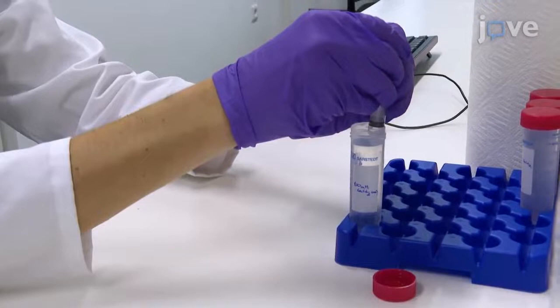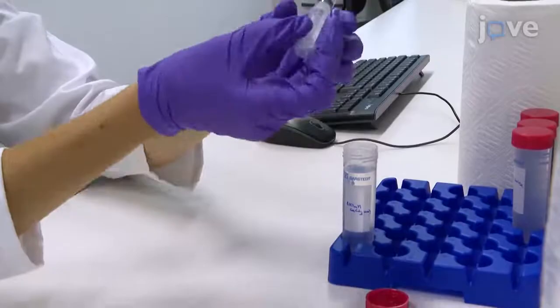Fill a second 5ml syringe equipped with a 27 gauge blunt end needle with freshly prepared crosslinking solution.